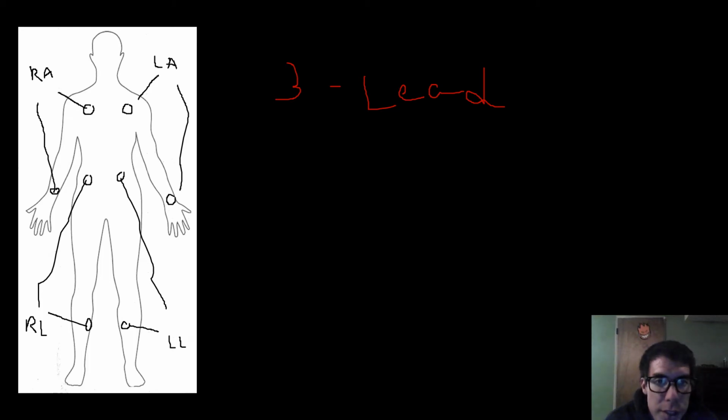I'll actually draw that up here so you know, 3-lead, 4-lead. People call them both things. I actually like calling it a 4-lead, but it's technically not a 4-lead because it gives you 3 leads when you look at it, but just know either way.